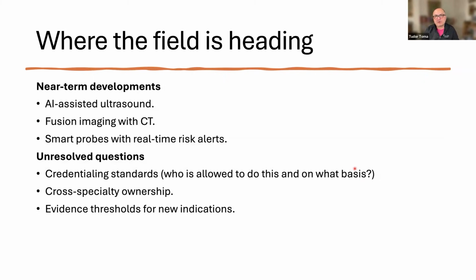But for applications where the image acquisition is more complex, such as, for example, the diaphragm, or in general clinical practice when we do multi-organ ultrasound for the diagnosis of patients with dyspnea, looking at the heart, the image acquisition of the heart, even if you do a focused cardiac examination, is a little bit more complex than the respiratory image acquisition. And I think that's where the AI is helping.